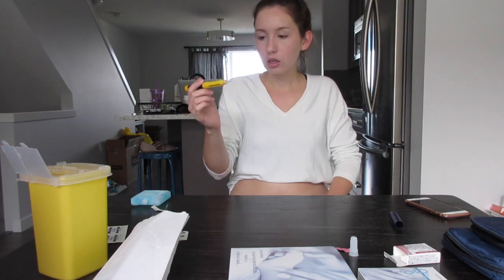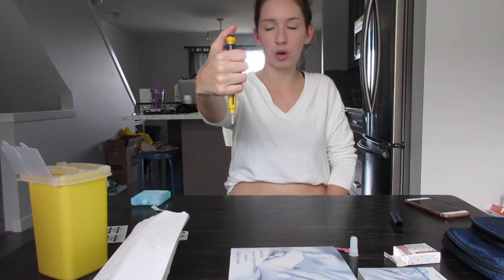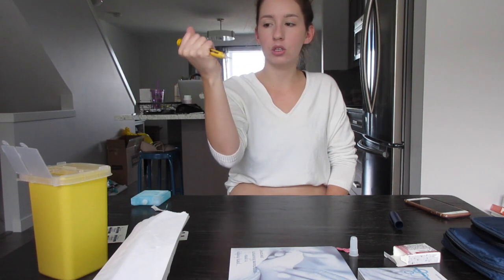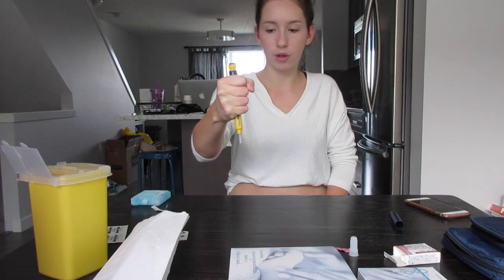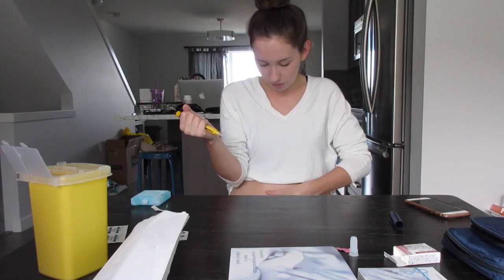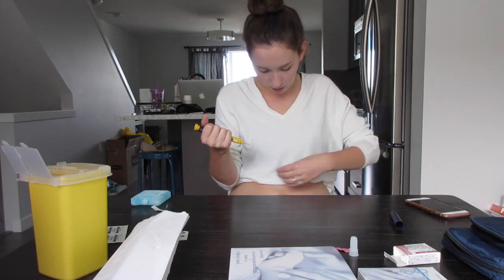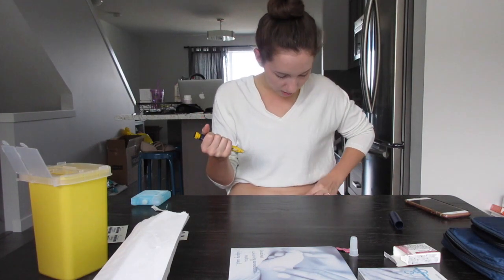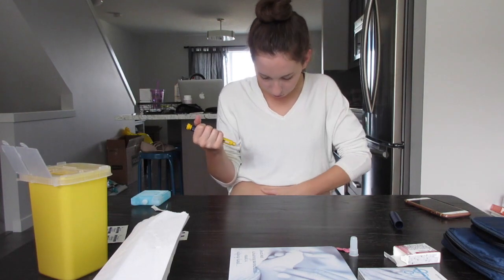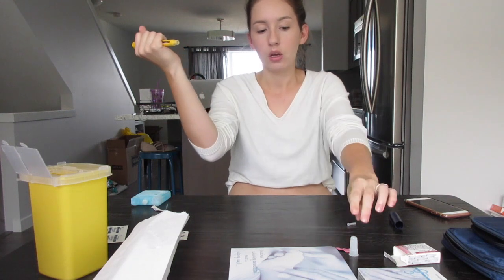So when you're ready with the pen, you use it like this. Your thumb is going to be pushing the bottom down, and you're going to be holding it with your full hand. You will take the other hand and pinch a part of your skin, part of your stomach. They say to go around your belly, not too close to the belly button. So around your stomach. So take off the lid.